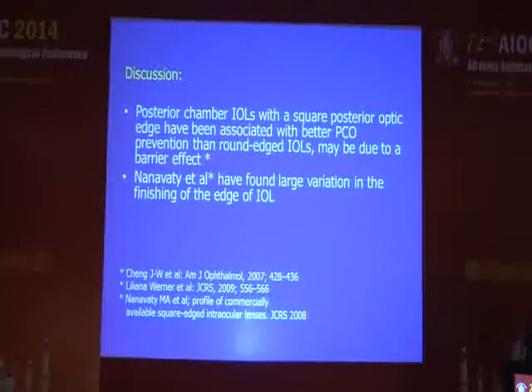Posterior chamber IOLs with a square posterior optic edge have been associated with better PCO prevention than round edge IOLs. It may be due to a barrier effect. Nanavati et al. have found large variation in the finishing of the edge of the IOL.